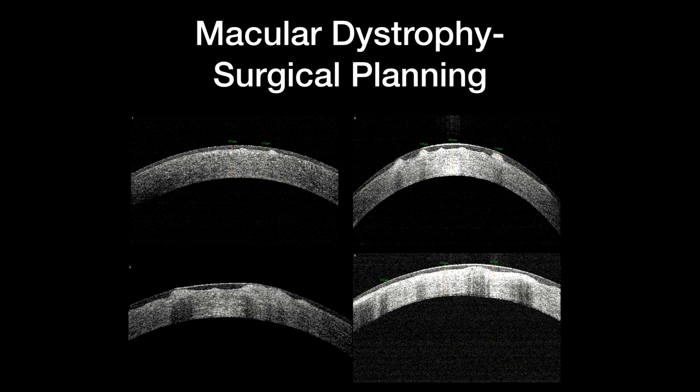It shows what all can be done with these. So the first patient has a superficial involvement. You can do a PTK or an SALK, or superficial anterior lamellar keratoplasty. The bottom right and the bottom left cases have both anterior and posterior involvement and can undergo a DALK.